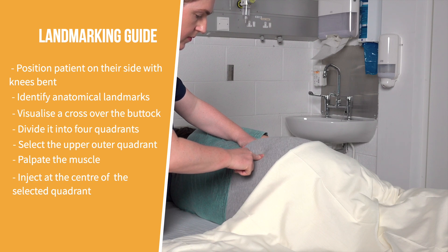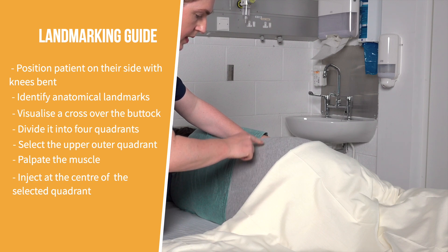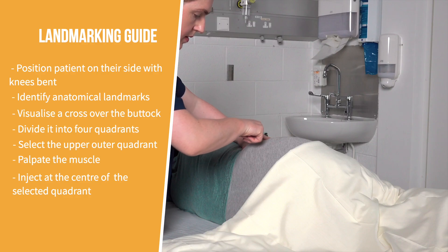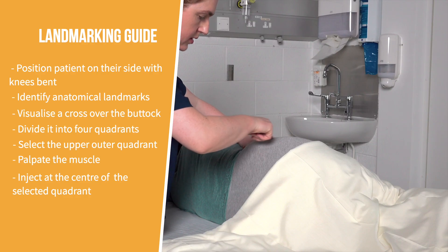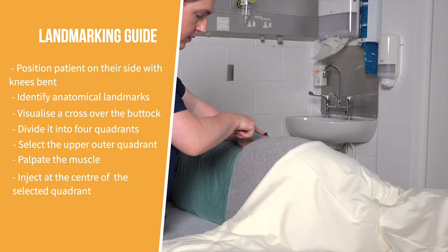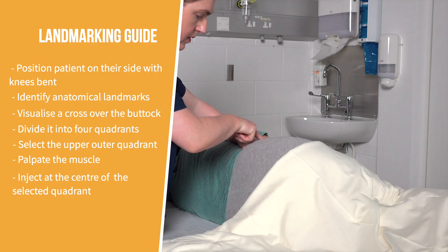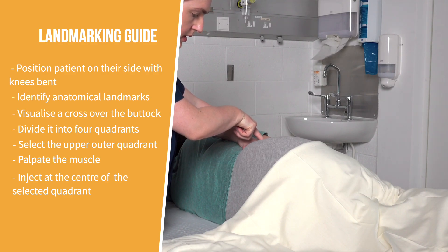The injection should be administered at the center of this quadrant. Gently palpate the area to ensure adequate muscle mass and avoid bony prominences or blood vessels.